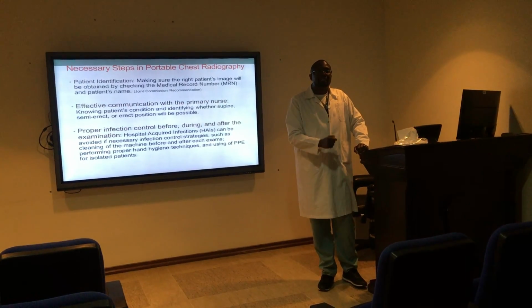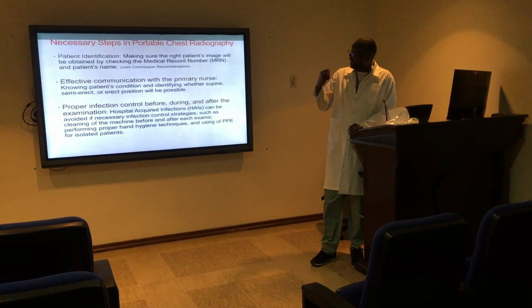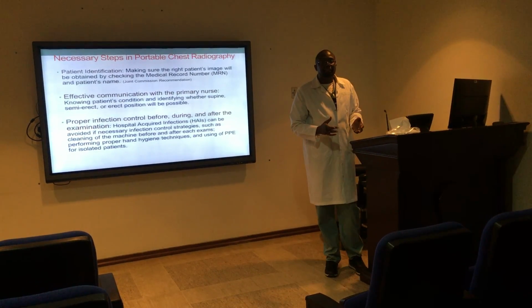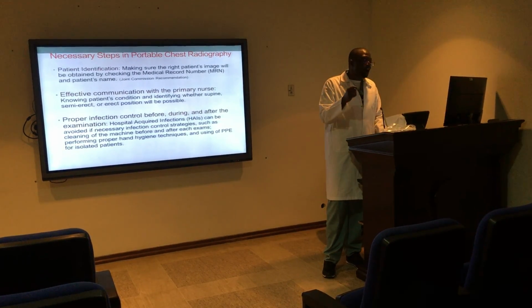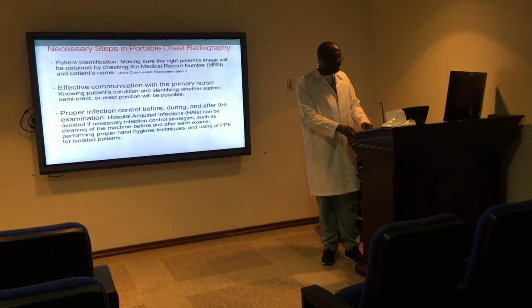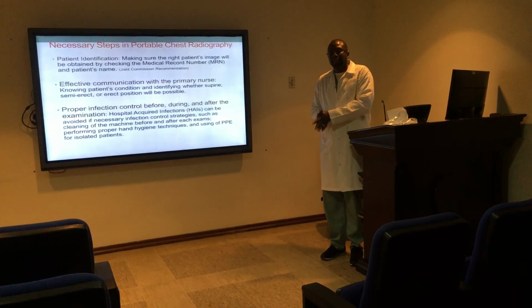So it's very important that we clean our machine before, during, and after examination. This will prevent nosocomial infection, which is now well known as hospital-acquired infection. We can avoid this by cleaning our machine before and after each examination.